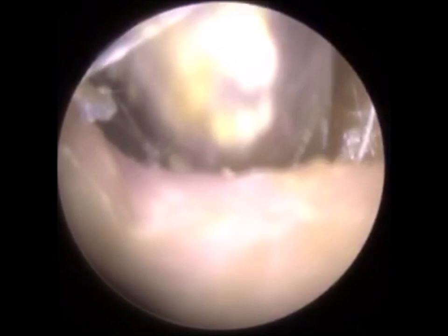So you can see us making slow but steady progress. And with these procedures, it is patience. Patience is a virtue. There's no shortcut. I wish there was. I don't enjoy spending an hour removing wax from the patient's ear. I can sure tell you my hand and my arm are extremely fatigued and tired after this procedure. But there's no other way. As I said, you can't use drops. It's keratosis obturans, which is the hardest thing to remove from a patient's ear. Quite often these procedures are performed under general anaesthetic by an ENT consultant.